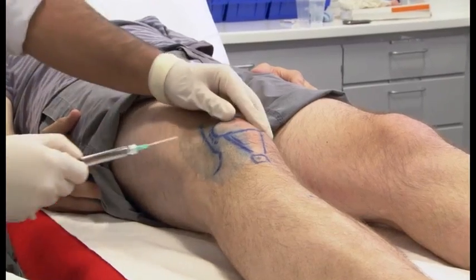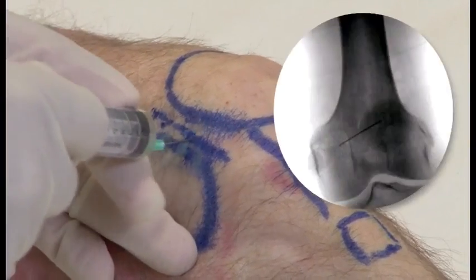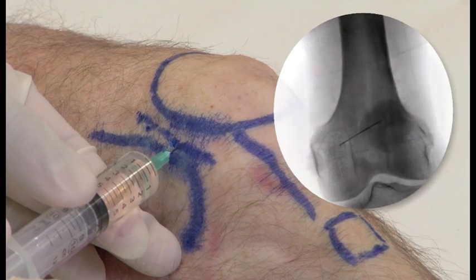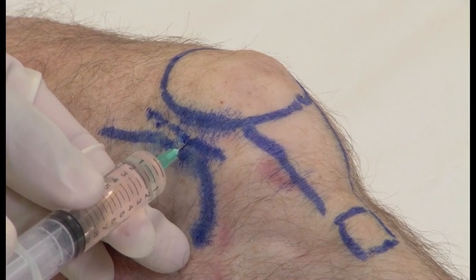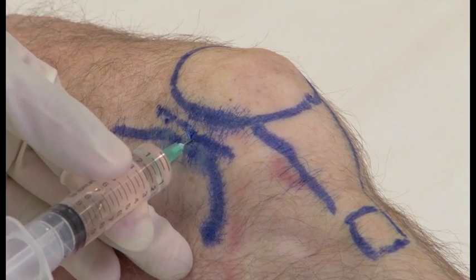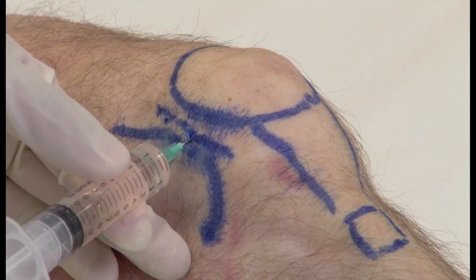Once anaesthesia has been achieved, one then inserts the needle into the retropatellar area and aspirates the fluid. Remember never to bury the hilt of the needle into the skin in case the patient suddenly moves. If that happens, then the needle may break off and actually be lost inside the knee joint.